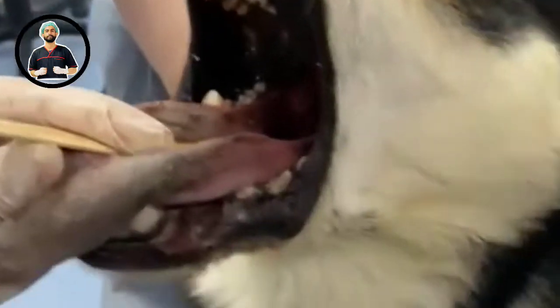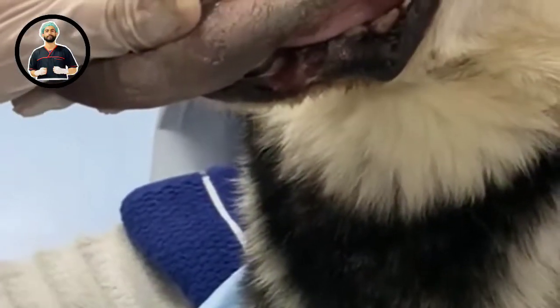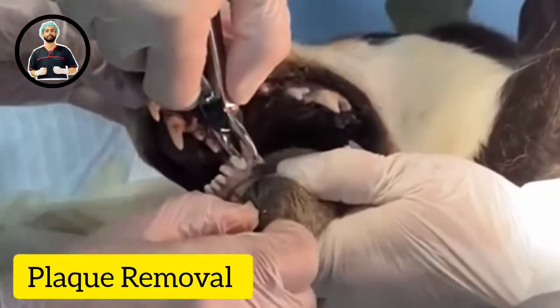Just pushing the tongue down opens up the airway area immensely. You can use a light source so you can see better. Even on a frozen cadaver that's not showing normal anatomy, pushing that tongue down opens up the space immensely. You can see the palate right at the back.